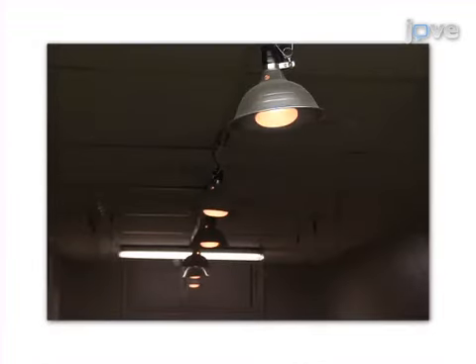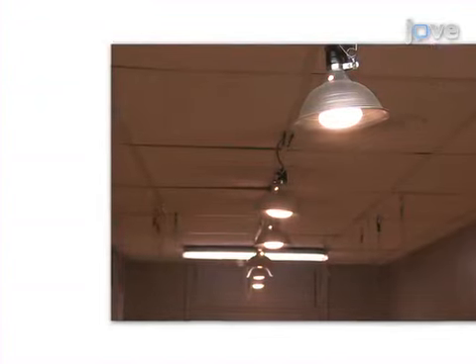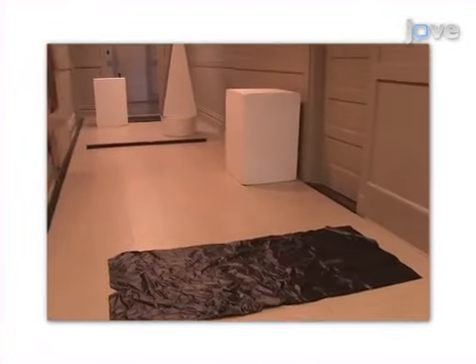Next, the testing area is prepared for use. The lighting should be set to the desired illumination and the styrofoam obstacles placed.